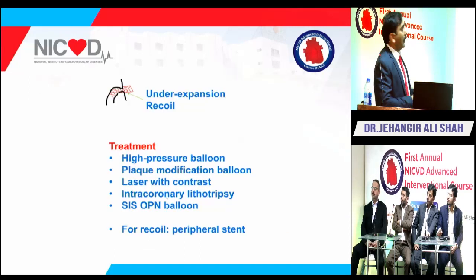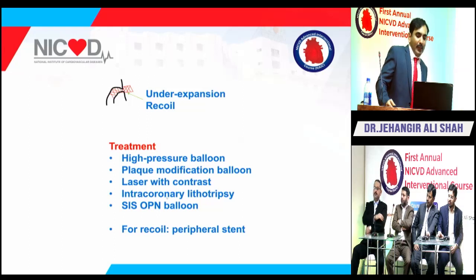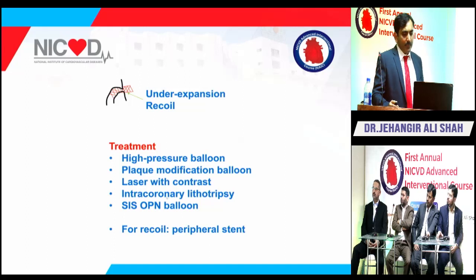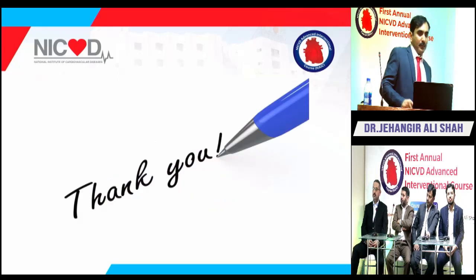Under-expansion is a very common problem you can see in the aorto-ostial lesion, in which you have to prepare the bed with aggressive pre-dilatation with a high pressure balloon, lesion modification with atherectomy and all, and you can use laser with contrast, intravascular lithotripsy, or OPN balloons, but sometimes you will observe that the recoil rate is very high. So you can use a peripheral stent, just like a renal stent, which has a high radial force, and the recoil of these stents is lower as compared to other stents. Thank you very much.